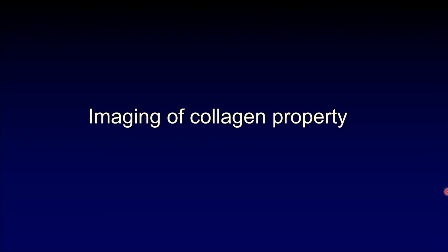Collagen property. So far, I demonstrated the scattering imaging with a standard OCT, and the vasculature imaging by using Doppler OCT and also OCT angiography, based on temporal correlation of the signal. And also RPE or pigment imaging by using the polarization uniformity. Then we also can do the collagen property imaging by using the phase retardation birefringence imaging. And its main application is scleral imaging. And especially it is useful for myopic cases.